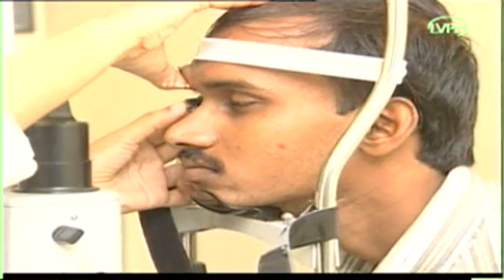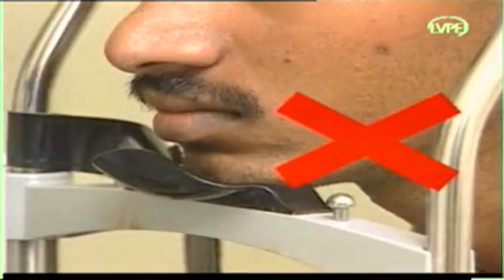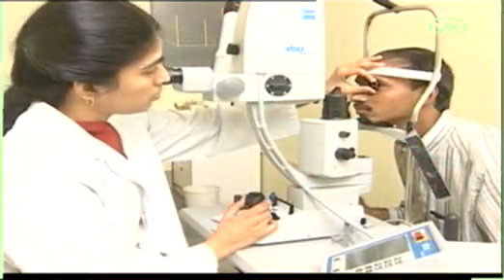Introduce the lens and ask the patient to look down in the direction opposite to where you will be aiming the laser beam. Now, aim the laser beam onto the superior and peripheral part of the iris. Focus the 4 spots of the helium neon beam, manipulating the spots until they merge into one spot. In case you do not achieve the beam as a single spot, move back from the oculars and check the position of the patient. Ensure that the patient has not moved the chin back in trying to look down, for then it would be impossible for you to focus the spots into a single beam.